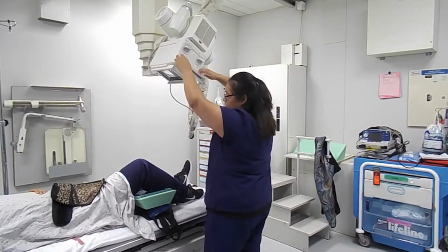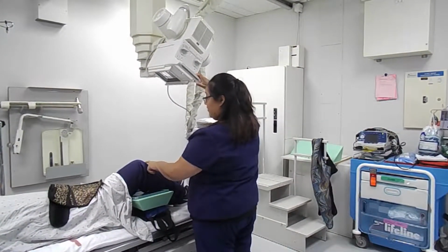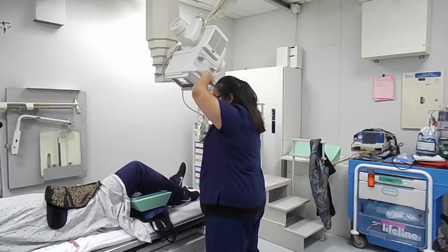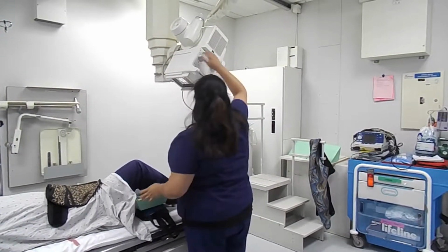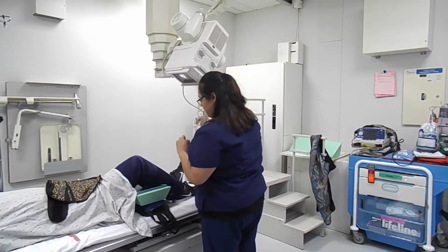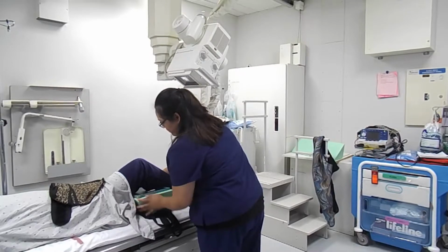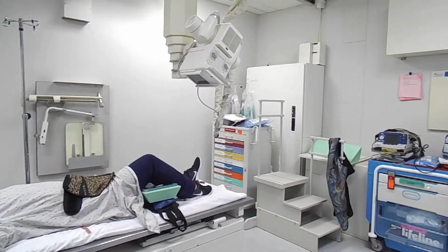And then center ray entering half an inch below the apex of the patella. Collimating appropriately. And then also marking our image. Okay, Ms. Garcia, stay still. X-ray.